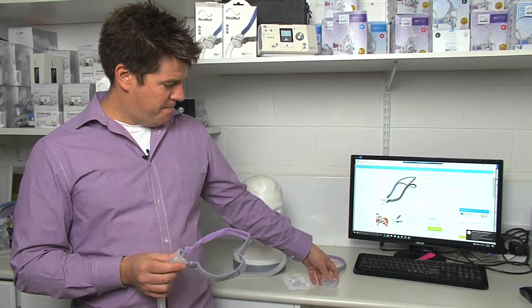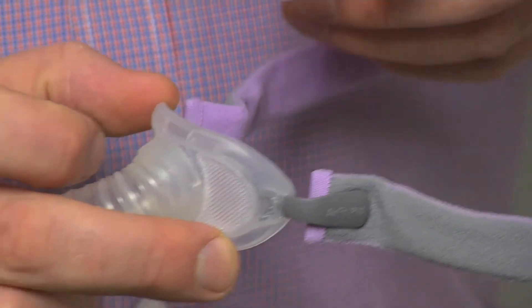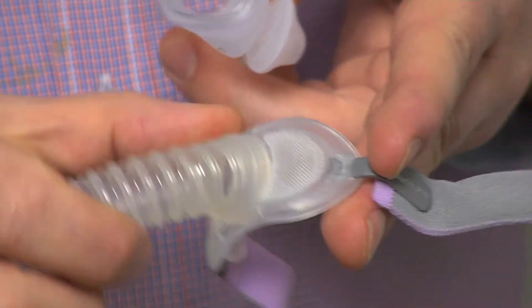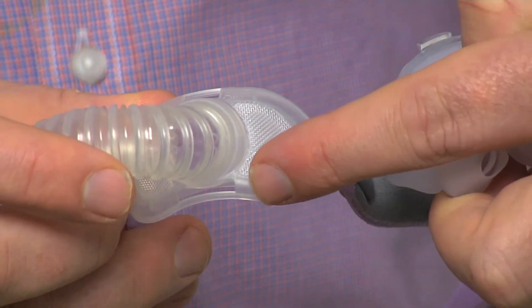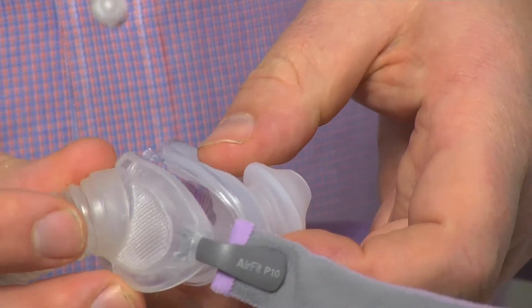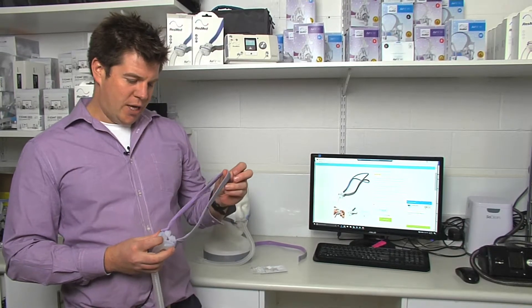The next step is to insert the pillow. There are two sizes with the clip — a small one and a large one. Make sure they connect up properly with the mask. You've got the small one on the top and the big one on the bottom. And click — your mask is now ready to use again.